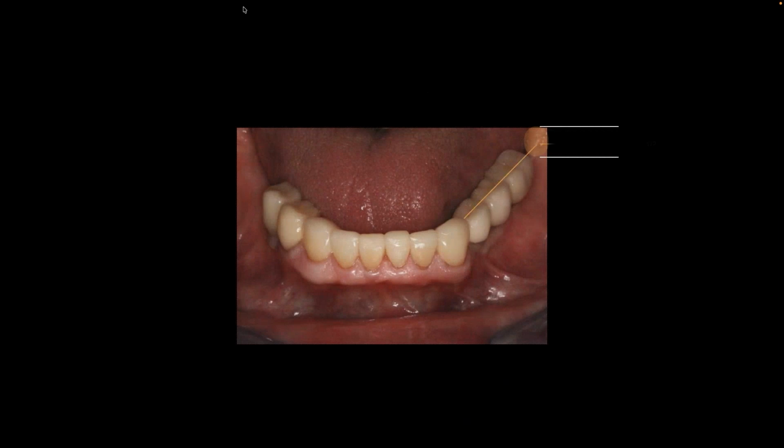What about the retromolar pad? A very important landmark. Remember that one? We know that the height of the occlusal plane in dentate people would be about half to 2/3 the height of the retromolar pad. And we basically duplicate that in fabricating dentures.